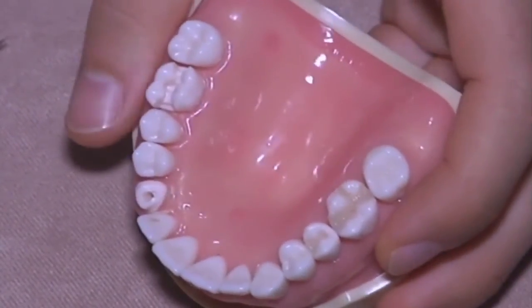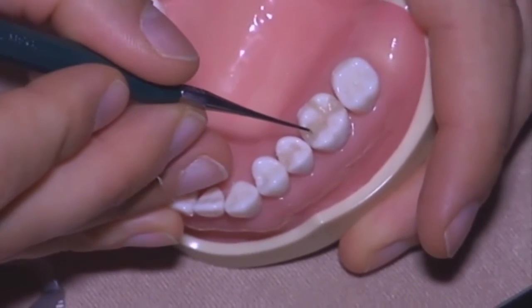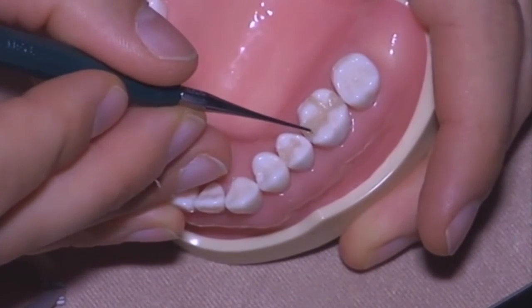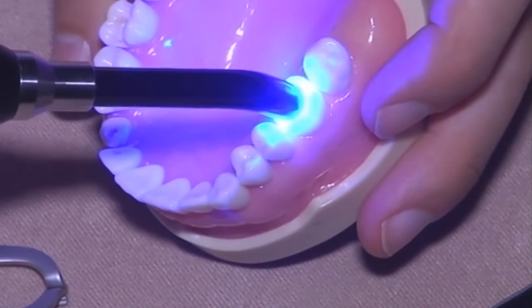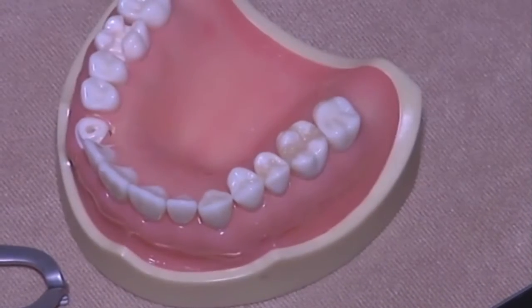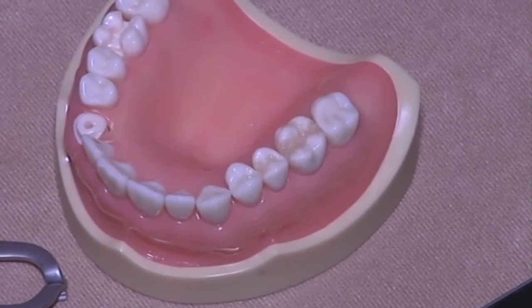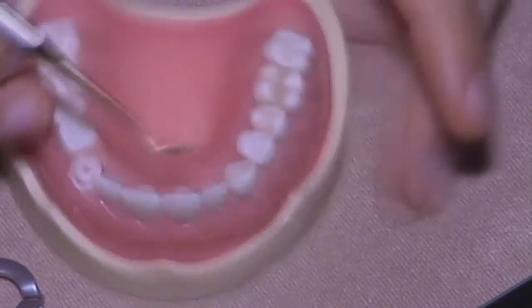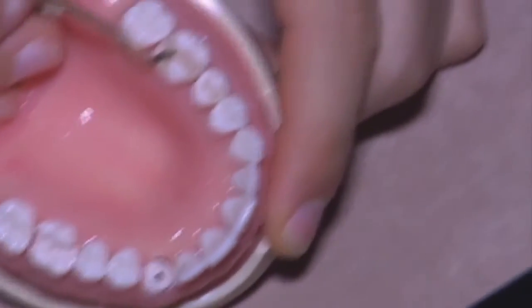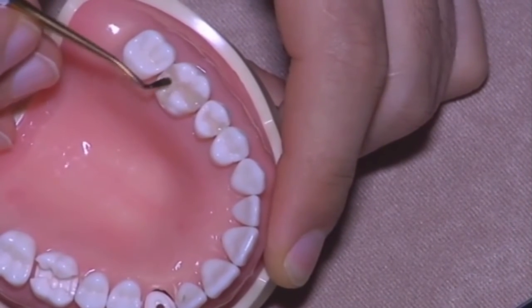Okay, let's just fix a little bit here. Fossa, that's it. Fourth part and last, and then we have already to close there.